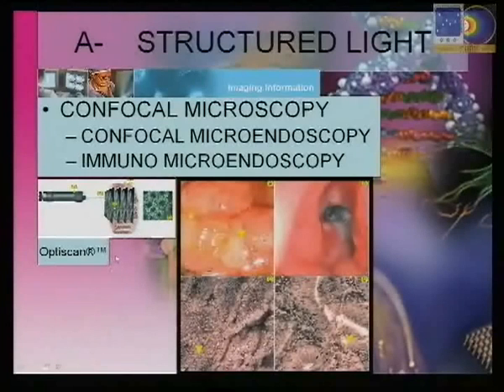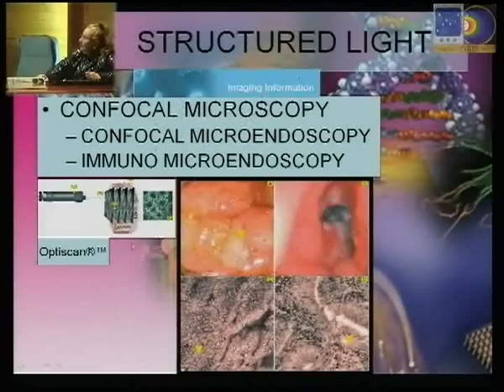The better resolution system, as you have seen, it will rise to 0.5 microns, is the confocal microscopy applied on living tissue, generally with endoscopy.